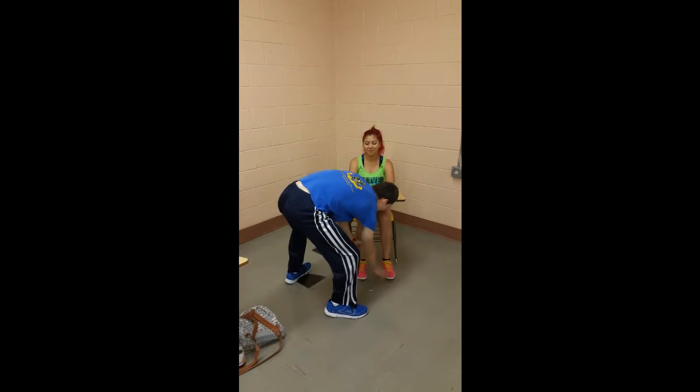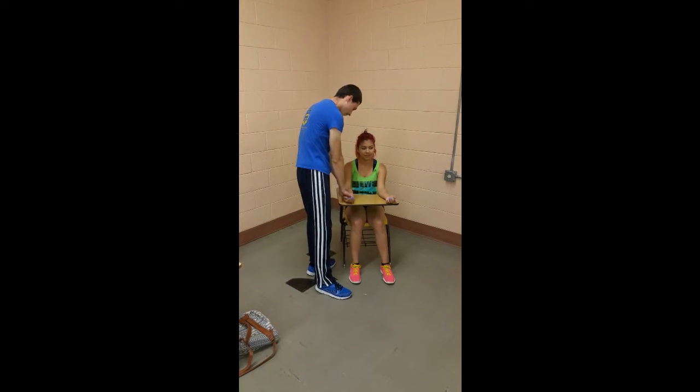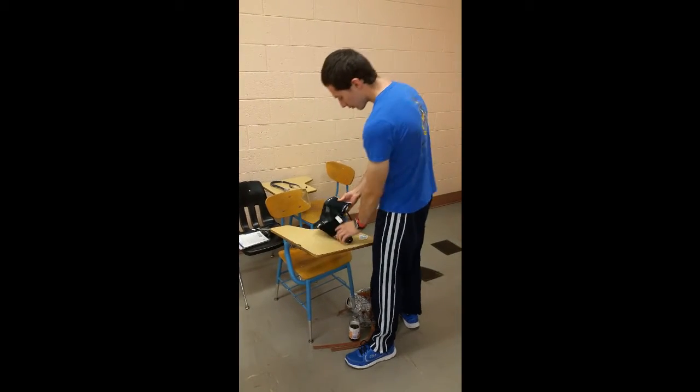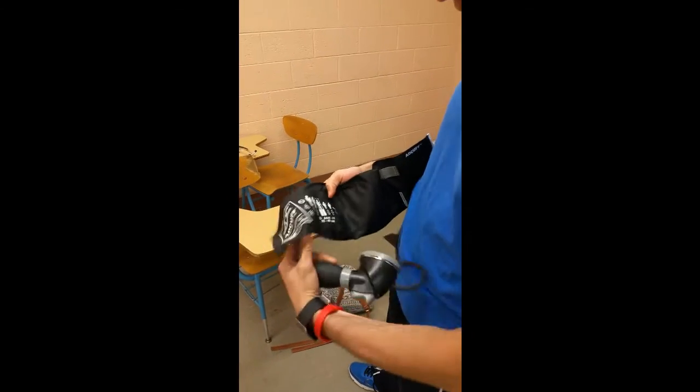To start off, make sure the subject's feet are firmly on the ground and that their arms are resting on a flat surface at heart level for 5 minutes. Next, grab your blood pressure cuff and make sure that it's the correct size. Diagrams are often shown on the cuff as a reference.